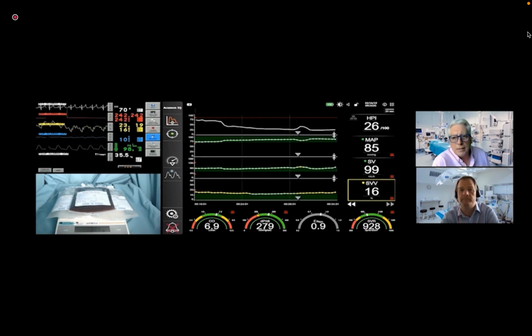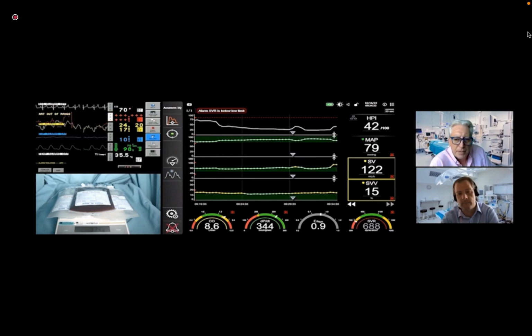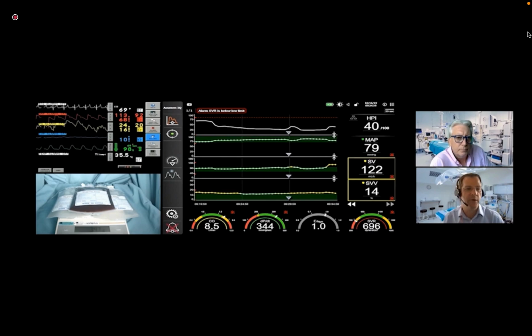Right, there's a lot happening with our high-end monitor at the moment. I think there's some line flushing going on. We've just got over the 125 grams or mils of blood. Remind us what percentage that is again? That's between 2 and 3% of our blood volume. 50 mils is 1% hemorrhage, and at 150 mils we're about at 3% now.